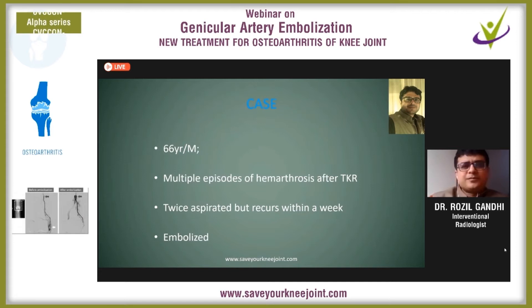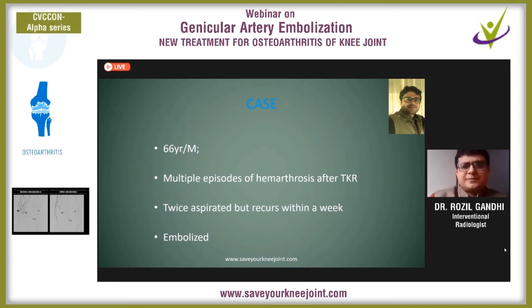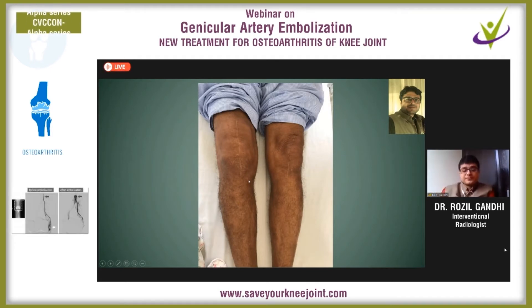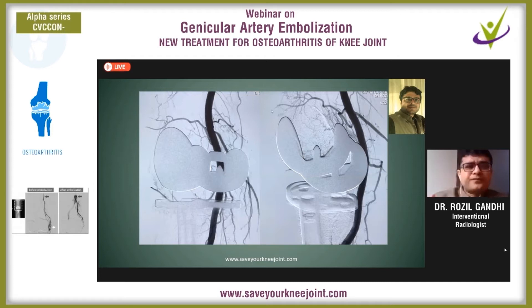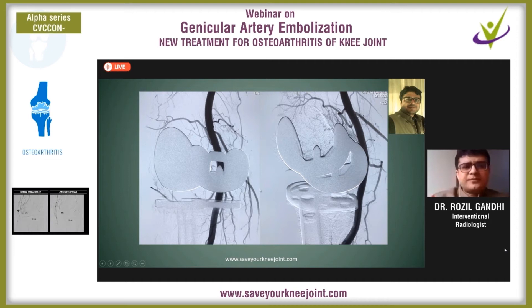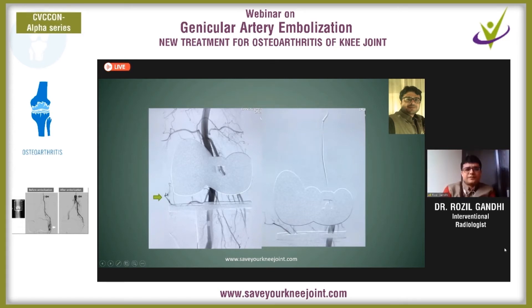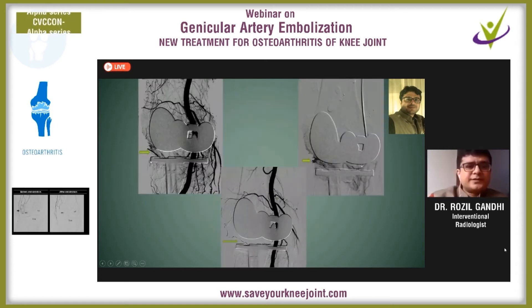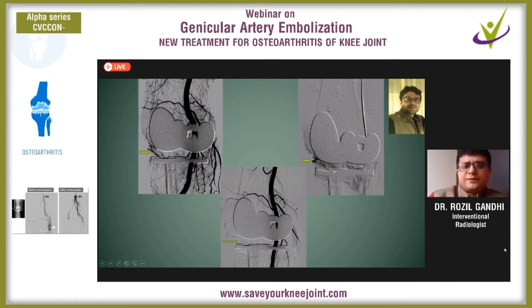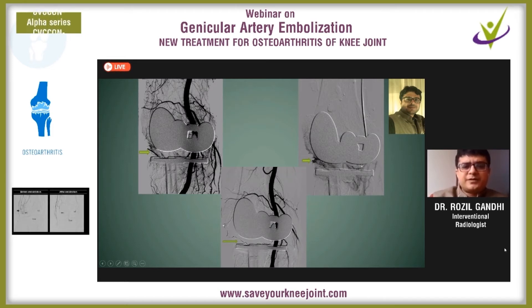Coming back to our genicular artery — multiple episodes of hemarthrosis after TKR in a 66-year-old patient, twice aspirated but recovered within a week. This is the clinical picture — you can see the right knee joint is swollen. This is the angiographic picture: this is the descending genicular, this is the superior medial genicular. This is the distal femoral subtracted angiographic image. You can see the abnormal blush from the superior medial genicular. We have gone super-selectively — the blush is seen better here — and this is post-embolization. The rest of the arteries are patent; the main trunk proximally is patent, but the blush is gone.